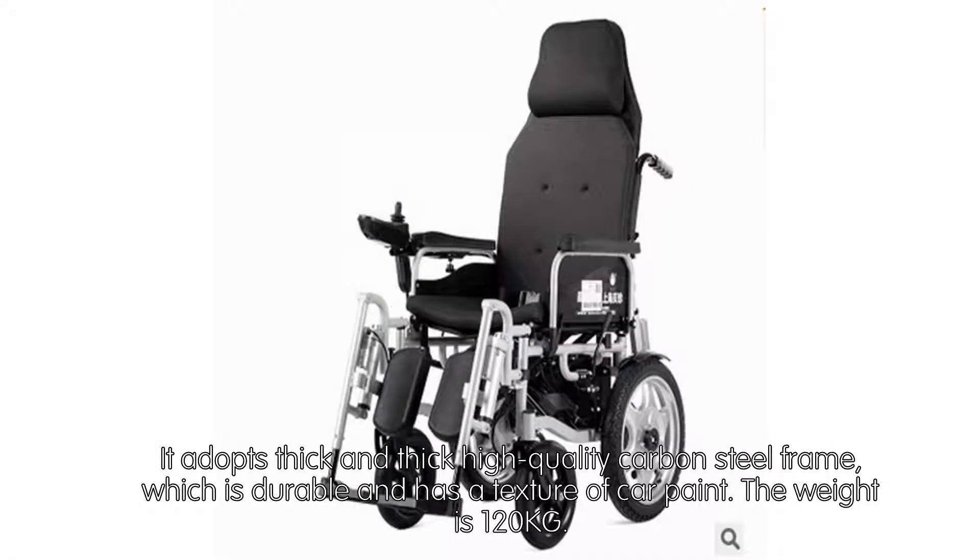It adopts a thick, high-quality carbon steel frame, which is durable and has a car paint texture finish. The weight capacity is 120kg.